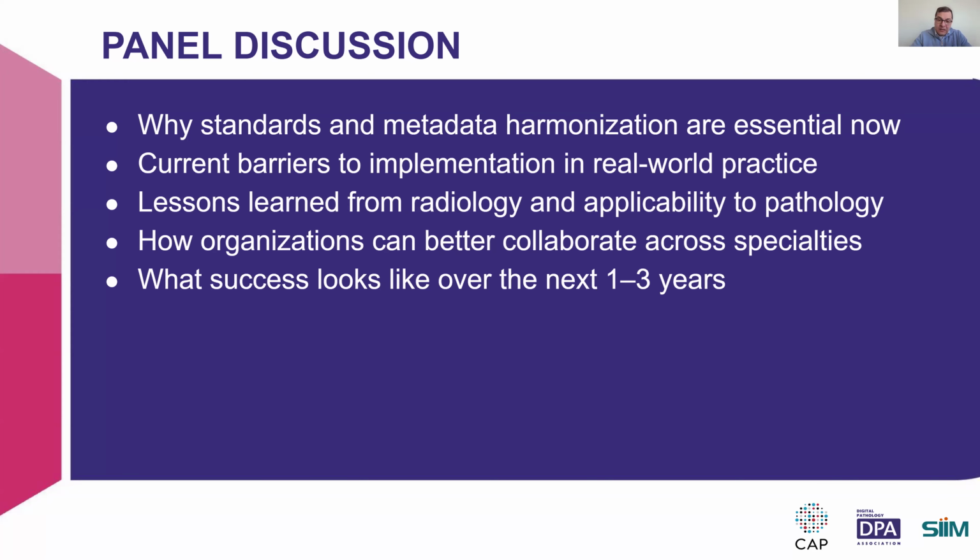And just like Dr. Dash would say, there is a lack of awareness in the pathology community. Many pathologists and pathology informaticists simply don't know a lot about DICOM as it applies to their domain. It has historically been for radiology, but the lack of awareness means there is really no clinical demand for adoption at that institution. Without that demand, vendors might have little pressure to prioritize and adopt it.